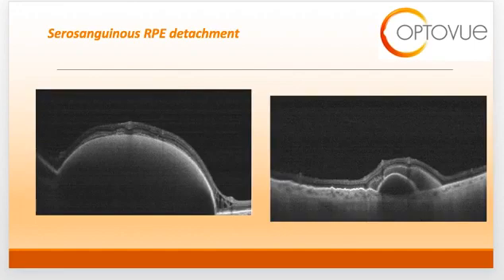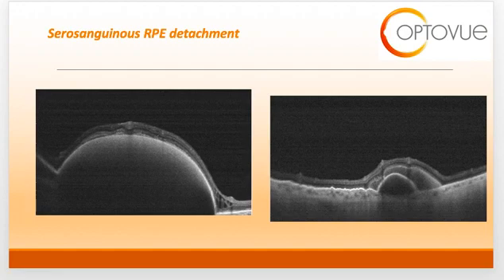This last slide shows what we call a serosanguinous RPE detachment, associated specifically with polypoidal choroidal vasculopathy. Serosanguinous RPE detachments are composed of serous fluid and blood — 'sero' meaning serous and 'sanguine' meaning blood — so there are two components to the pigment epithelial detachment. OCT findings typical of polypoidal choroidal vasculopathy include multiple large PEDs, as seen in these images.